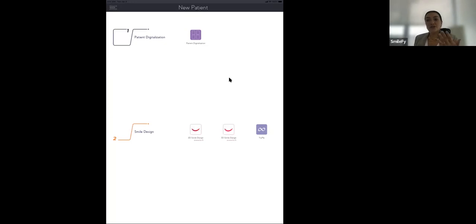You can start by introducing yourself and saying, hey, I need a picture. It's part of our procedure to take a picture. Let's do a simple smile simulation pretty fast. You can train somebody else from your team to get started with the picture. And you can explain that you use artificial intelligence to help the patient during the clinical evaluation.